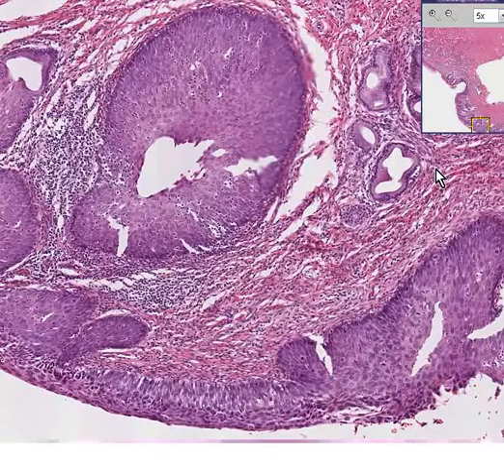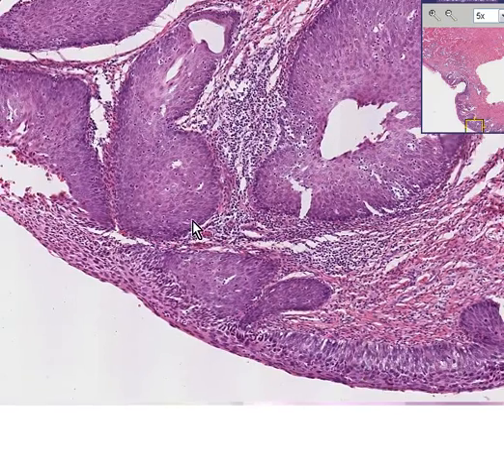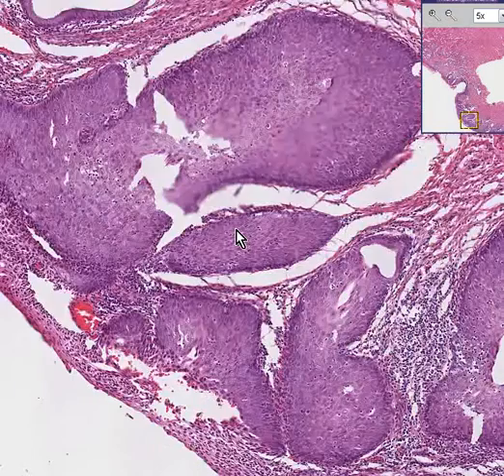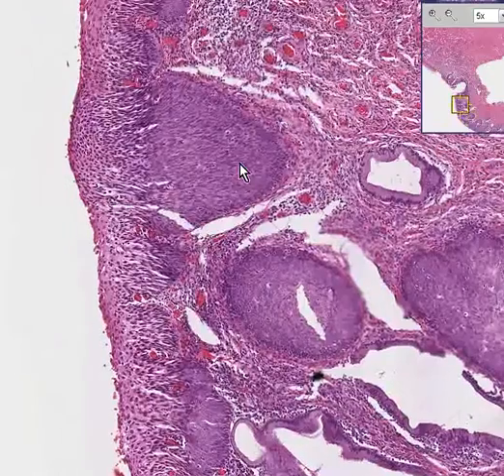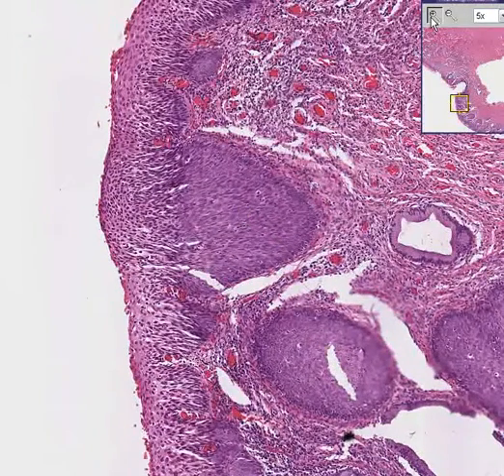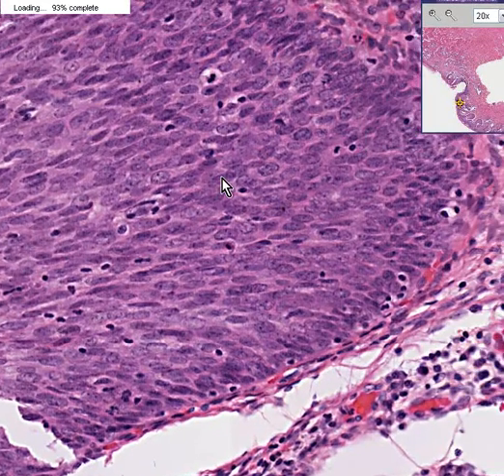And you would expect or hope that the overlying mucosa was also glandular, but it's not. It was perhaps once a glandular or columnar epithelium, but now it has been replaced by multi-layered or stratified squamous. This process is called metaplasia. But in addition, if you look at this abnormal squamous epithelium, especially places like here, for example, and we go up a little bit further, we'll notice that not only is this a stratified squamous, but it is abnormal.